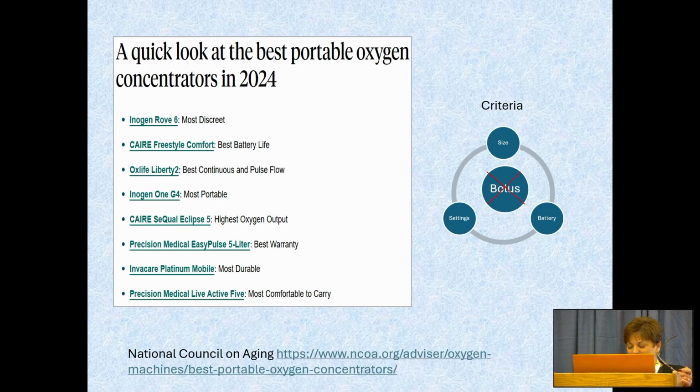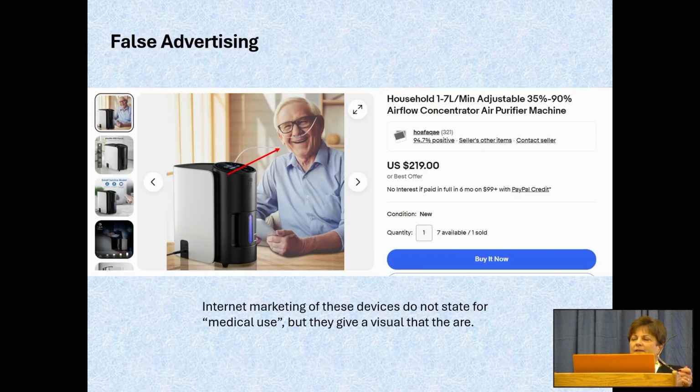They don't understand the output. So we really need to encourage our patients. I pulled some false advertising, and I'm going to talk about a study that was done and published in Respiratory Care a few months back. But the false advertising, if you go out there and look at some of these ads, they have physicians sitting there with a lab coat talking to their patient, and they have a nurse or a respiratory therapist, a healthcare professional sitting there with them talking about it.